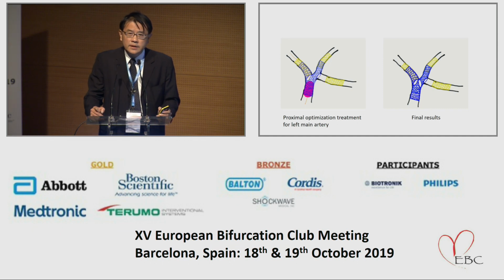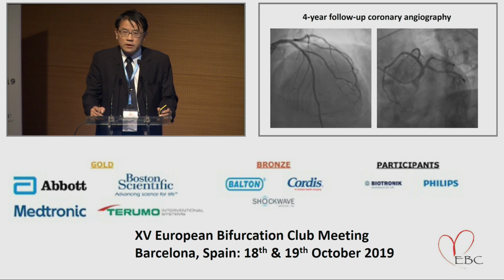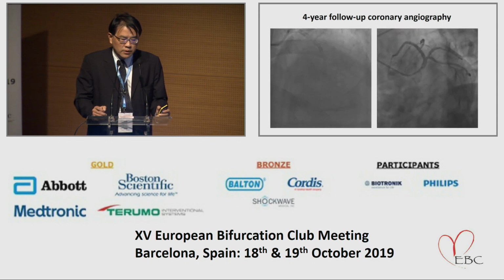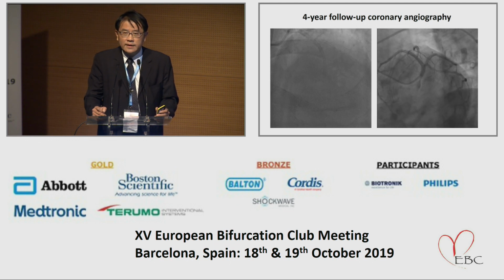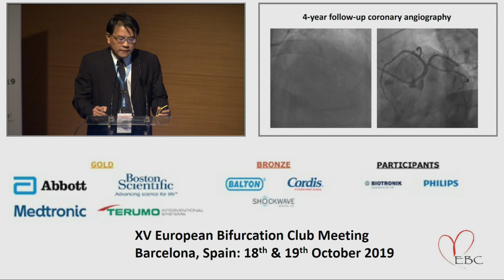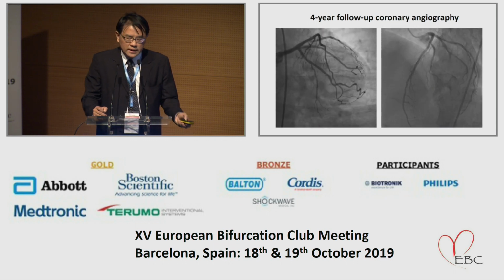How about the midterm result? 4 years later, this patient received follow-up angiography. You can appreciate the stent remains in a very good pattern. It looks like the immediate result after the index PCI 4 years ago. From the other two views, we can see a similar result.